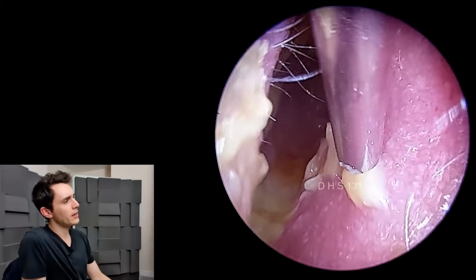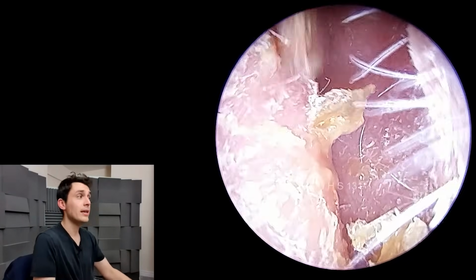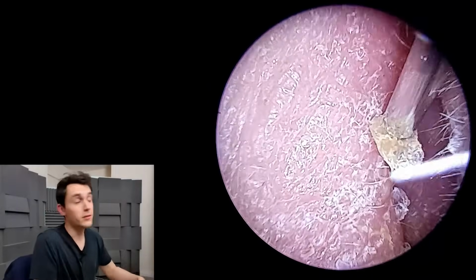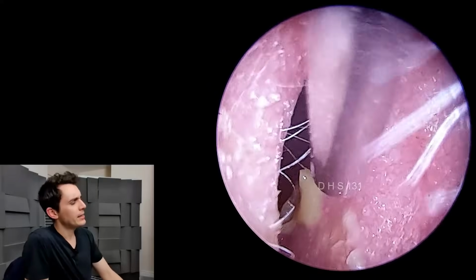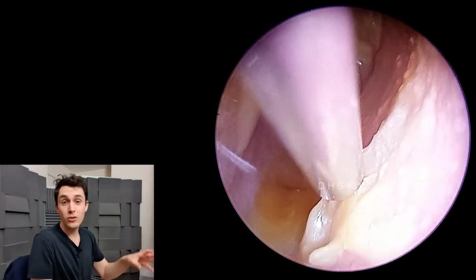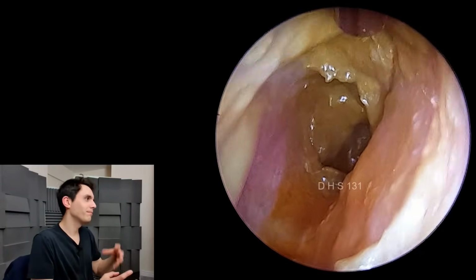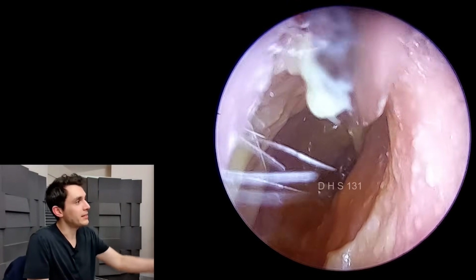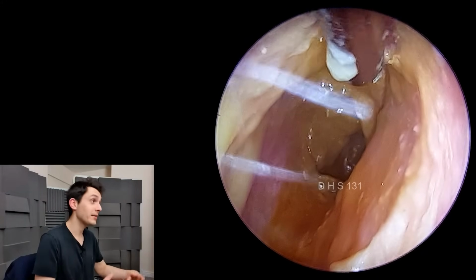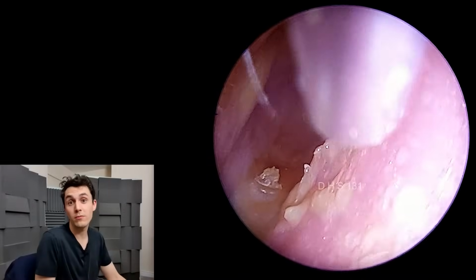This is an ear infection. In fact, I've seen this patient on a number of occasions, and both of his ears are always infected. This is a chronic problem, and all things considered, his ear at the moment doesn't look too bad. This is probably the best I've seen it. There's a little bit of pus and obviously lots of dead skin down there, but all things considered, it's okay. There's a little bit of swelling and inflammation, but normally both ears are full to the brim with pus, basically.